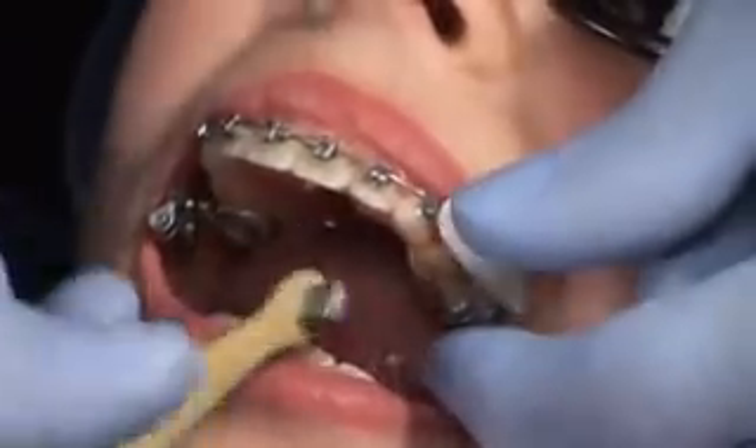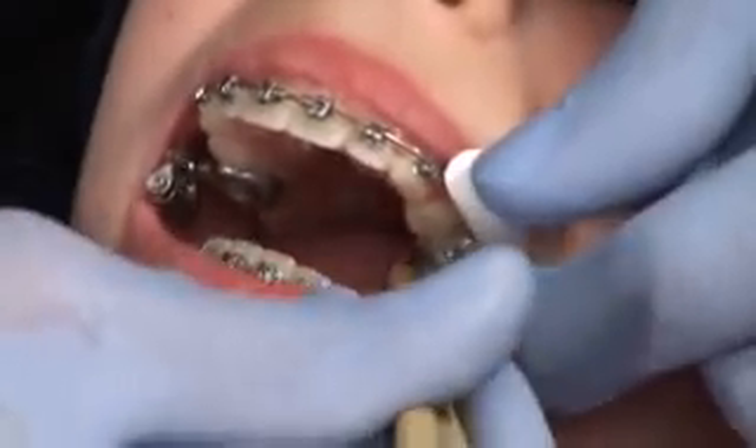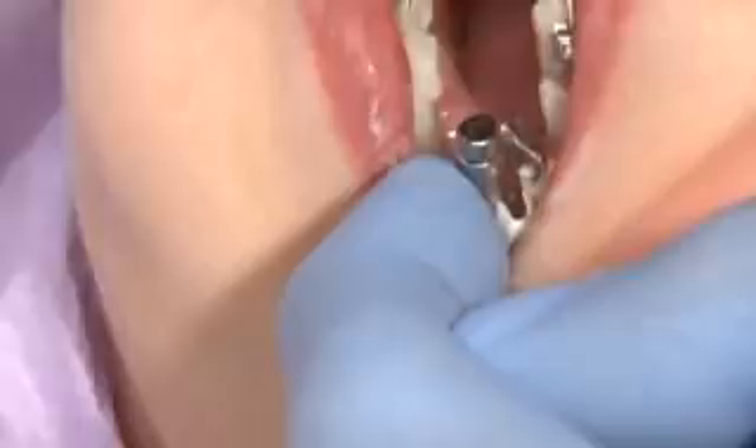Clean residual cement from the teeth using a cotton roll. Let cement cure according to manufacturer's instructions. Since the tops are cut out of the crown, you should clean off any excess cement on the occlusal surface. This will make it easier to remove the crowns later and decrease the amount of time needed for cleanup.